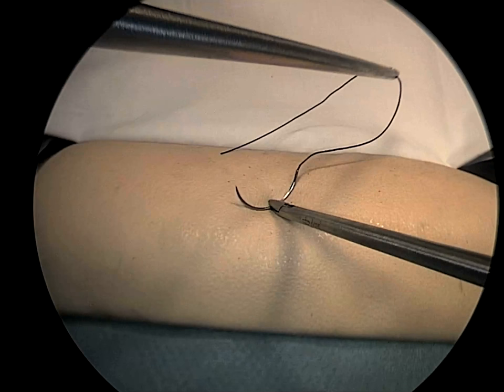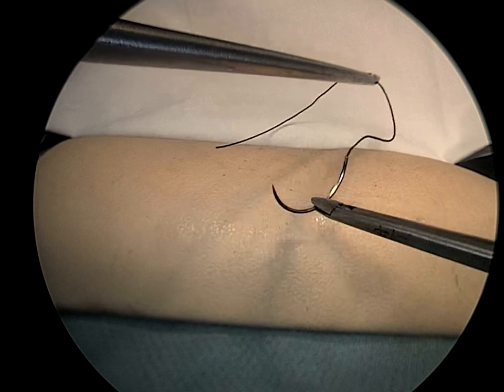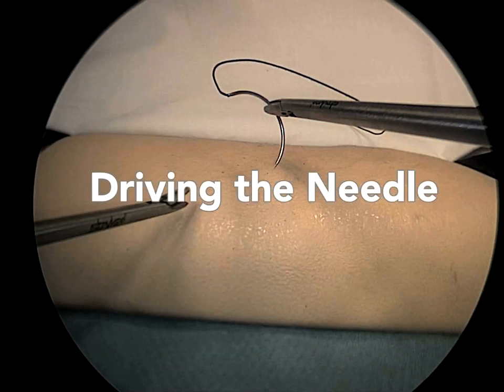Needles can be safely loaded on bowel, colon, or peritoneum. In this next sequence, driving the needle according to its curve is emphasized.